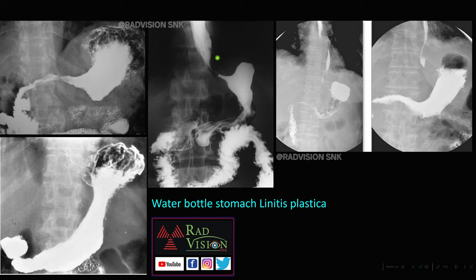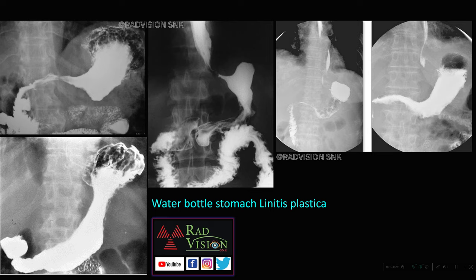Here you can see diffuse narrowing of the lumen of the stomach. This is also narrowing of the lumen of the stomach — classically described as water bottle stomach, seen in linitis plastica, which is scirrhous adenocarcinoma where there is diffuse submucosal infiltration causing luminal narrowing. Remember: water bottle stomach equals linitis plastica.